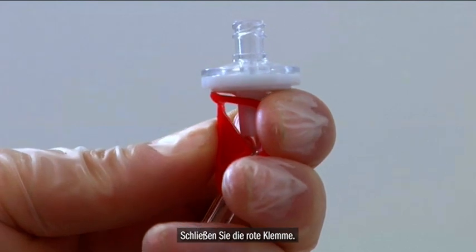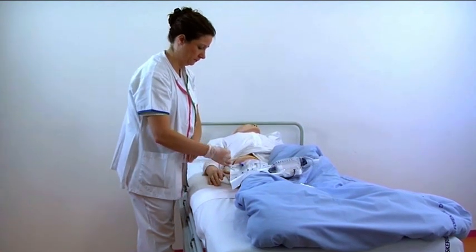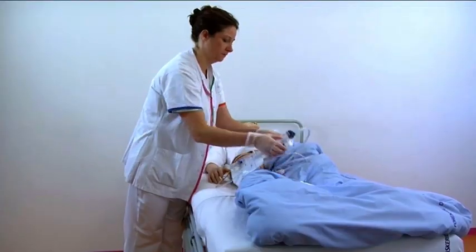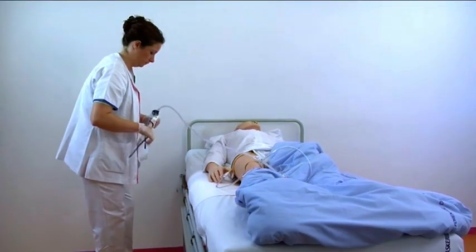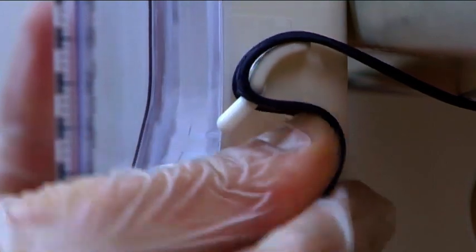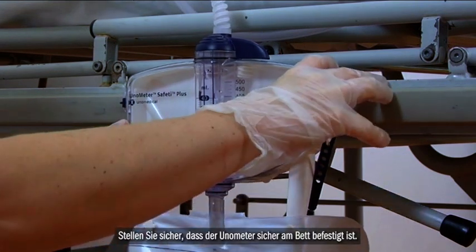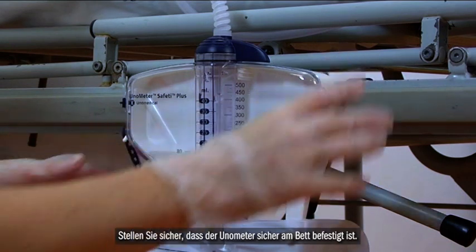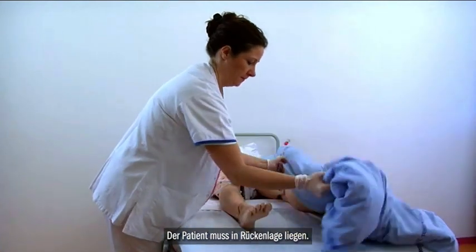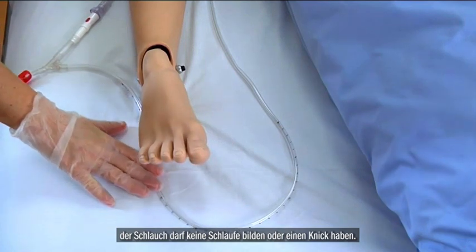Close the red clamp. Make sure the Unometer is attached correctly to the bed. Make sure the patient is lying down in a supine position. Then place the Unometer Abdo Pressure around the leg of the patient and make sure the tube doesn't kink or make a loop.